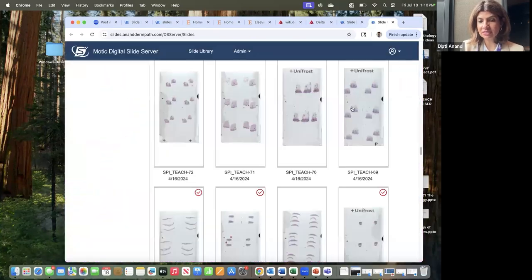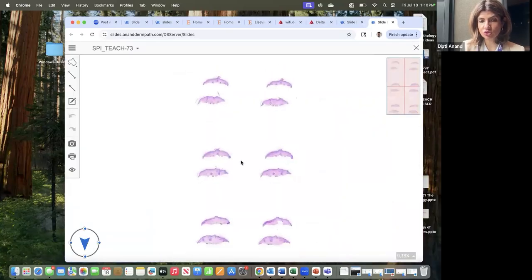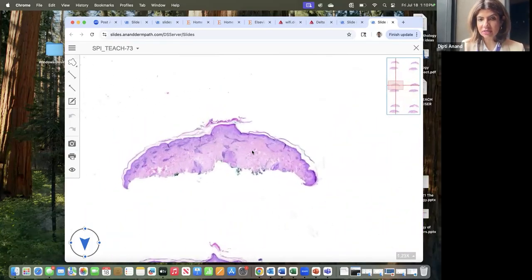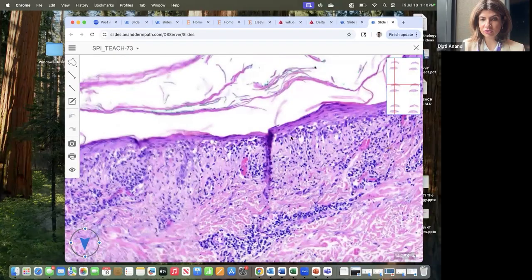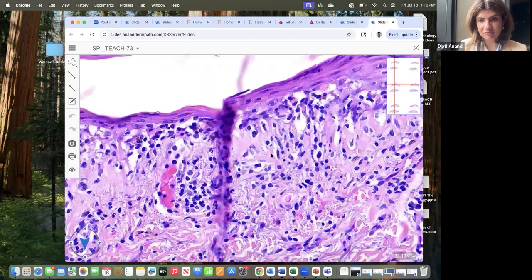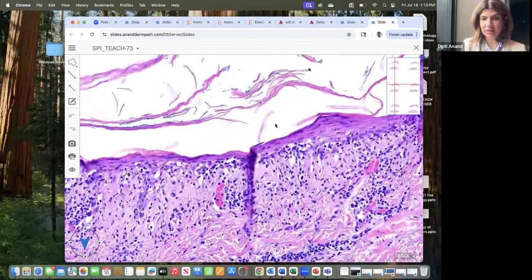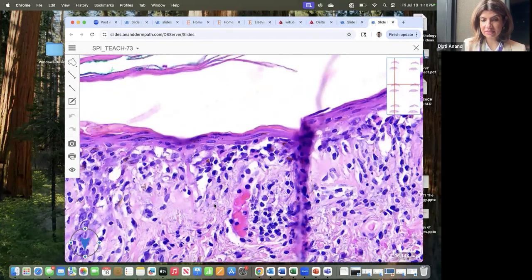Subacute cutaneous lupus is less inflamed. Subacute cutaneous lupus, which could be idiopathic or drug-induced, is the Ro and La mediated form of lupus. And what you see in here is, again, an interface dermatitis, right? Why? Because you see the holes and spaces. You see the necrotic cells, so it's interface. So now the next step is to classify it as acute or chronic. And yep, it is chronic. Why? Because you see the atrophy, you see the hyperkeratosis, and you see a very thick basement membrane. It begins here, it ends here. Begins here, ends here. You can see it's completely fuzzy and thick.